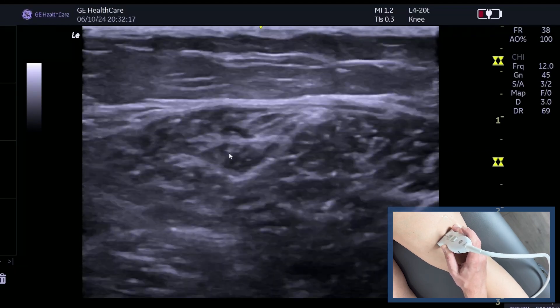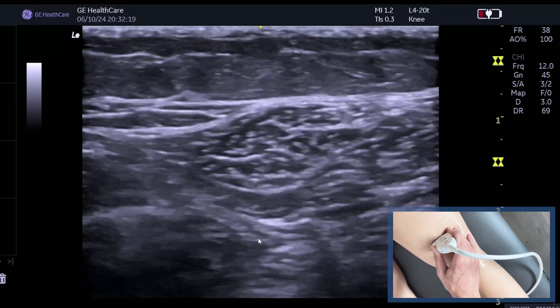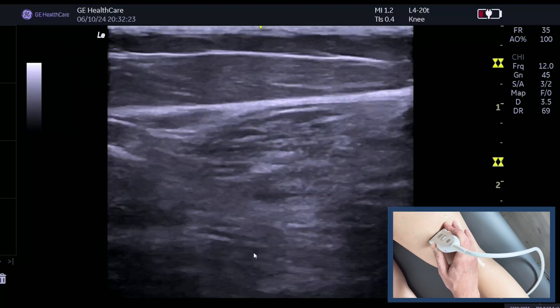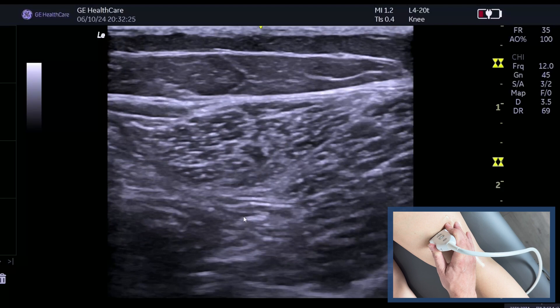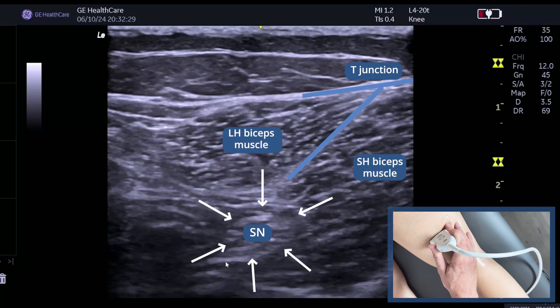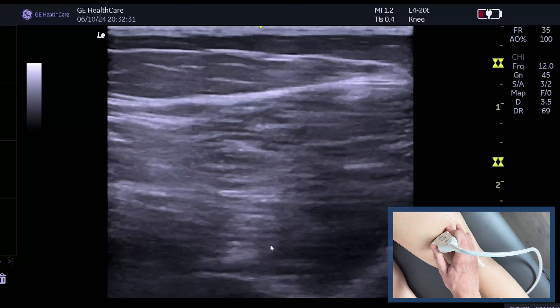Now if we go slightly further up, here we go — we can start to see the nerve. If I push a bit harder then we can see that nerve there. Now that's the sciatic nerve, that's the tibial nerve, and also the common peroneal.